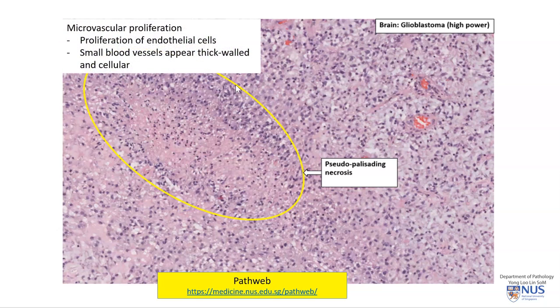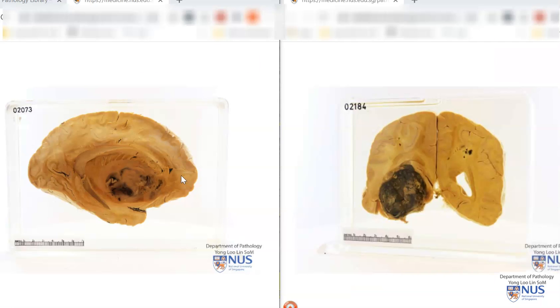Another feature is microvascular proliferation, where in the small blood vessels there is proliferation and piling up of endothelial cells so that these vessels appear thick-walled and cellular. In summary, we have two examples of a high-grade glial tumor — the glioblastoma — where on the left we see an ill-defined fleshy tan mass with areas of necrosis and hemorrhage, and on the right a somewhat better-defined, extremely hemorrhagic mass with areas of necrosis. These tumors are rapidly growing, aggressive, and carry a poor prognosis. Thank you.